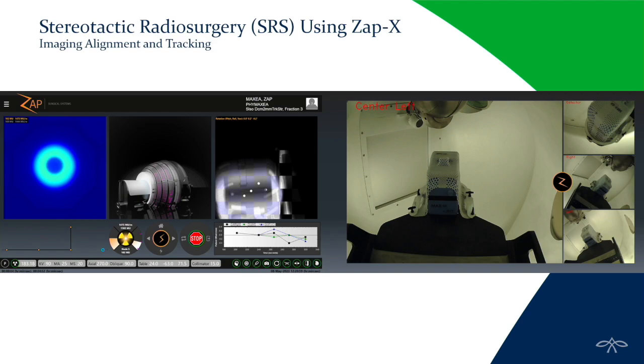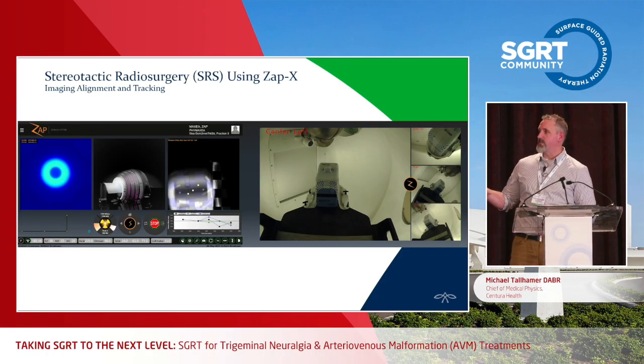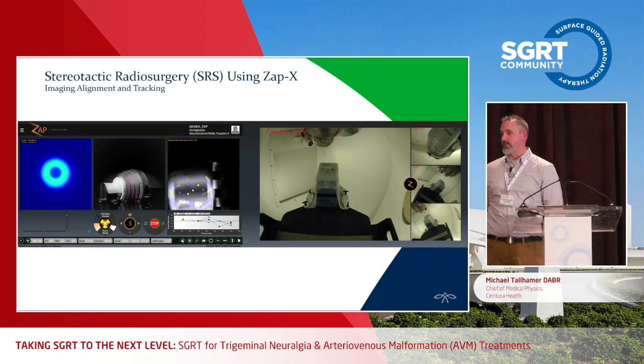This is the KV panel, and the KV source is under the patient at all times, and this panel travels within the cone of that X-ray source. And so you're getting different projections. The panel's tilted at 13.5 degrees. There's a lot of things going on that adds noise and uncertainty to these image fusions. They're all sub-millimeter. There's nothing wrong with this, but this is not the gold standard that we think we want when we say we want real-time imaging.